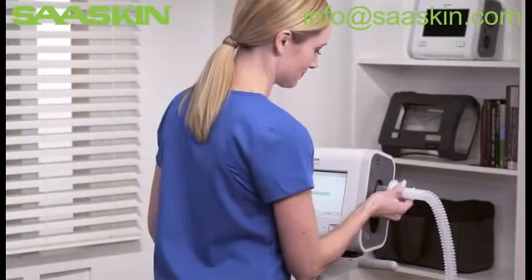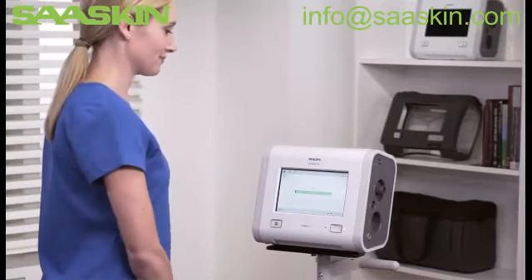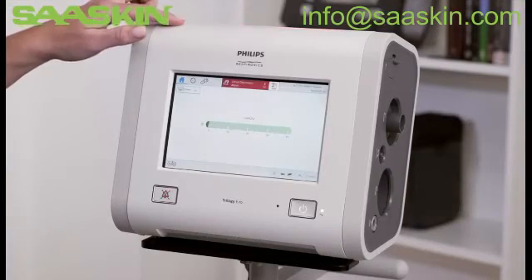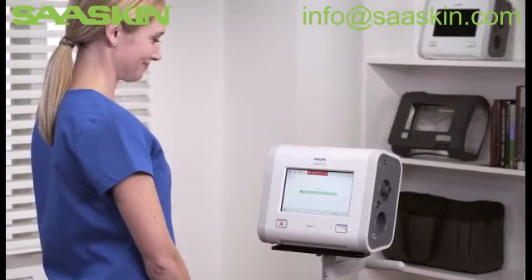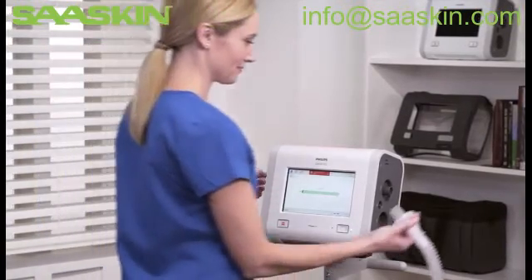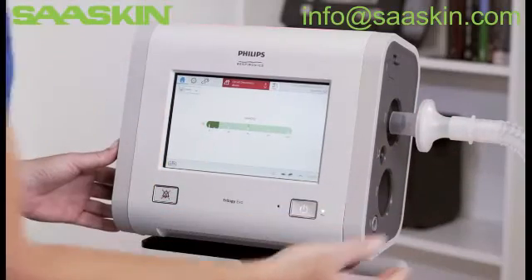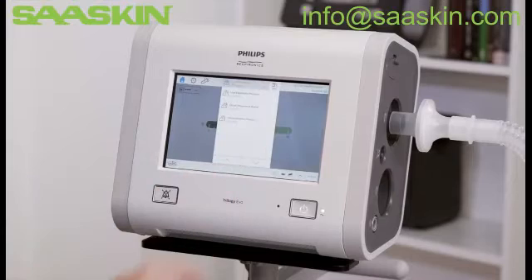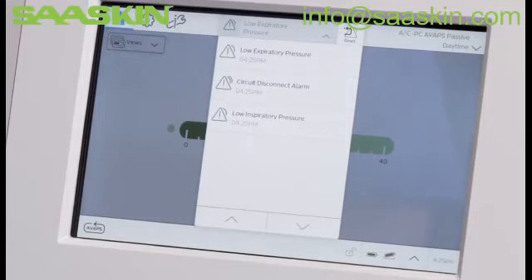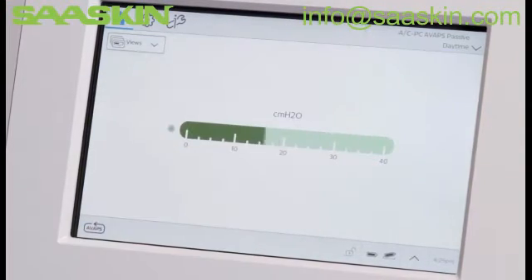If the circuit becomes disconnected during ventilation, you will see high priority indicators. In this instance, connect the circuit to resolve the alarm condition. To learn more about the alarm, tap the alarm list. Since the alarm has resolved, you can tap the Alarm Reset icon.